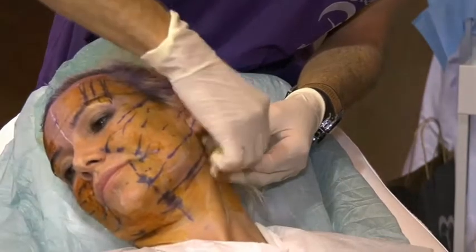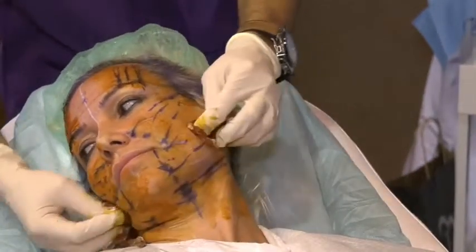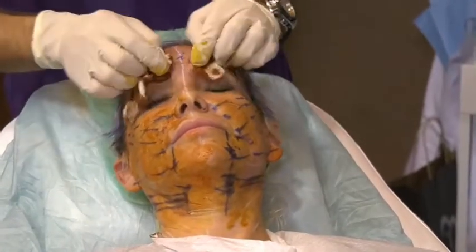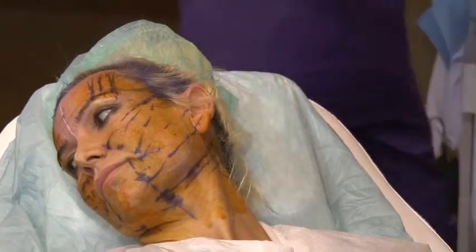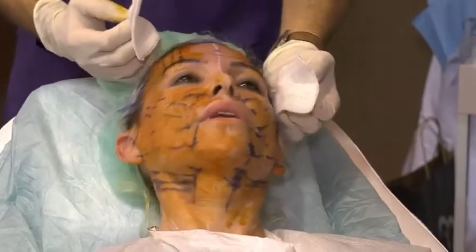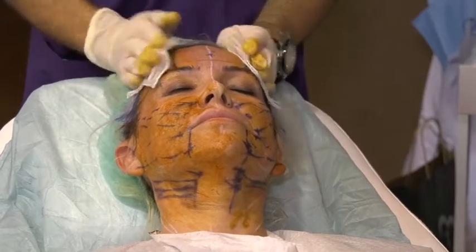Now we are ready to start our case. You know that we use the 2% lidocaine with epinephrine. Also, you can add a little drop of sodium bicarb in order to have that less painful. Can you adjust?